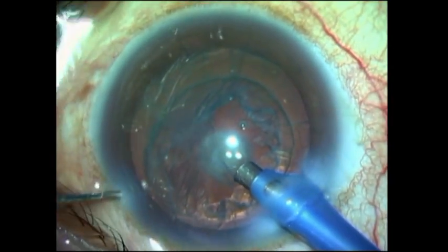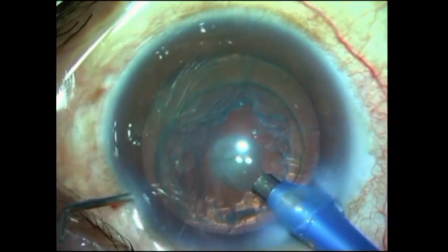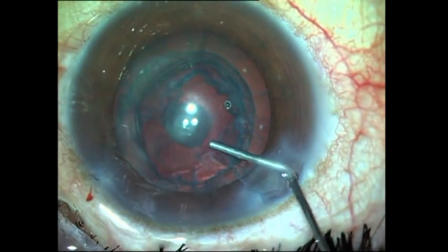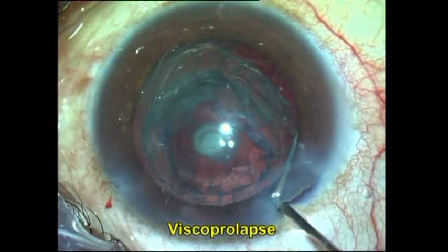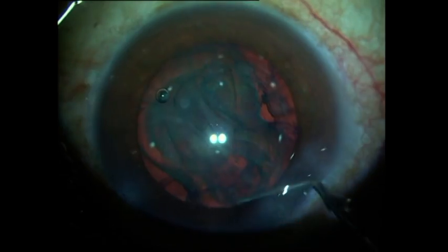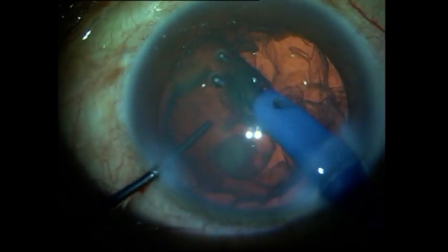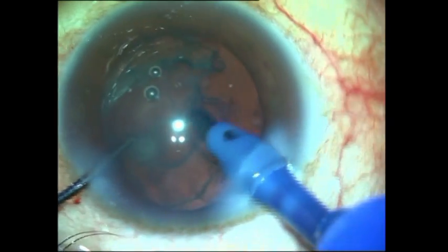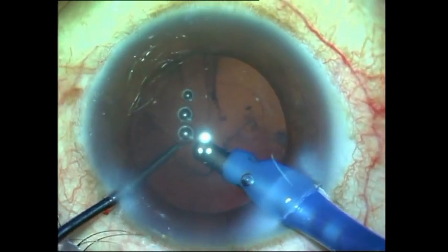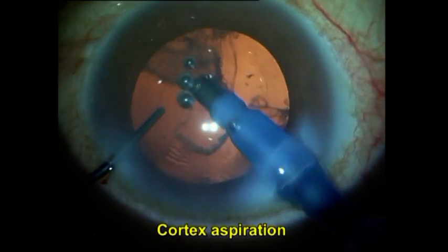In this case I do something which I may not always advise — a visco delineation. I try to bring the epinucleus out a little more by injecting viscoelastic into the space between the epinucleus and the cortex, and finally I aspirate all the cortex out very gently, making sure that I never apply the probe even in capsule polishing mode directly onto the posterior capsule.